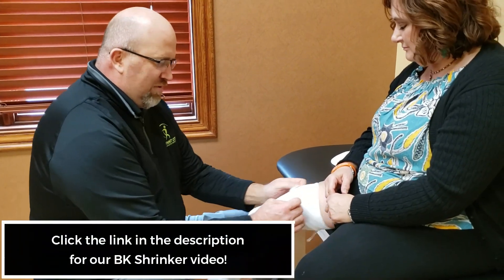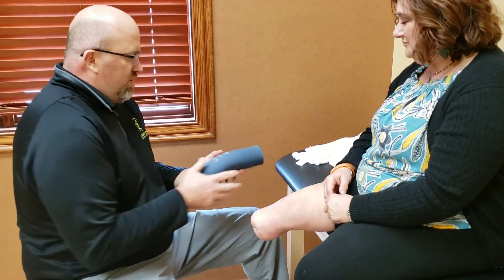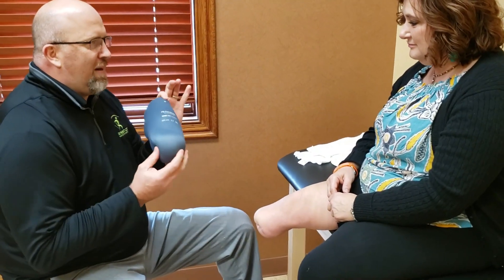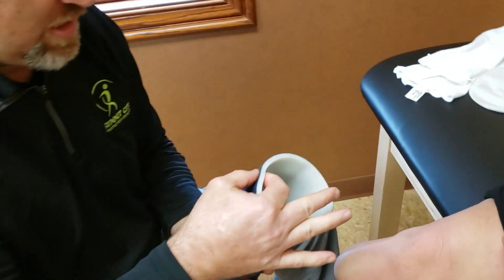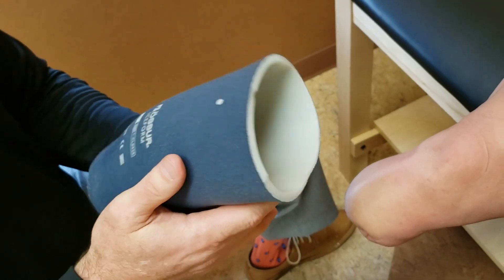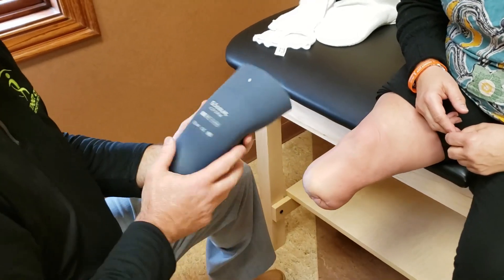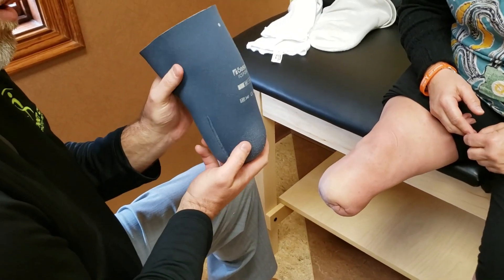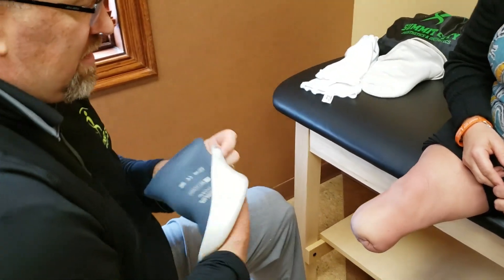With a liner, there are lots of options. In your case, we're using an Össur liner. It has a unique profile — the front section is thicker than the back section. That's important because the writing and the thick side is what's going to be oriented down the front of the limb. Whether the liner is on you or off you, it's always fabric out.